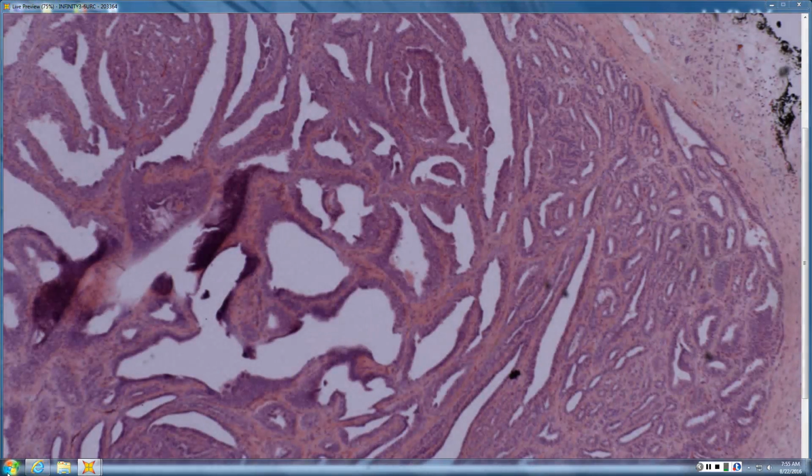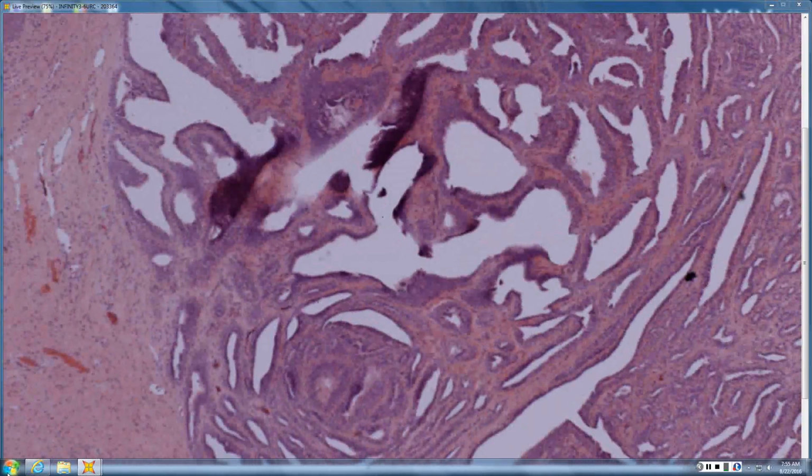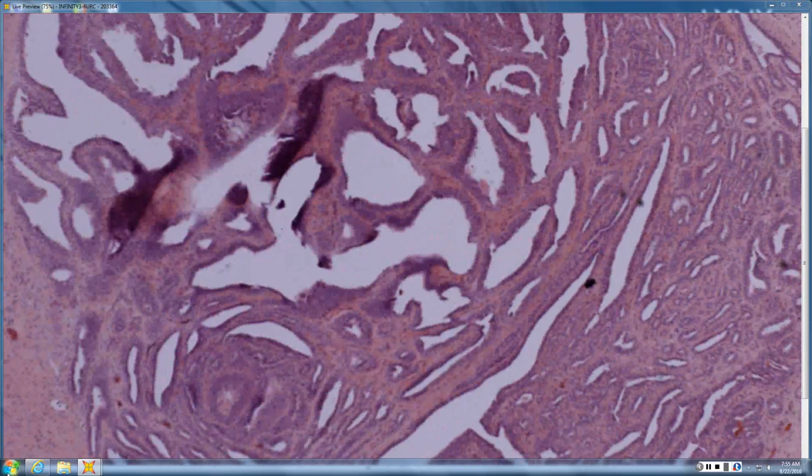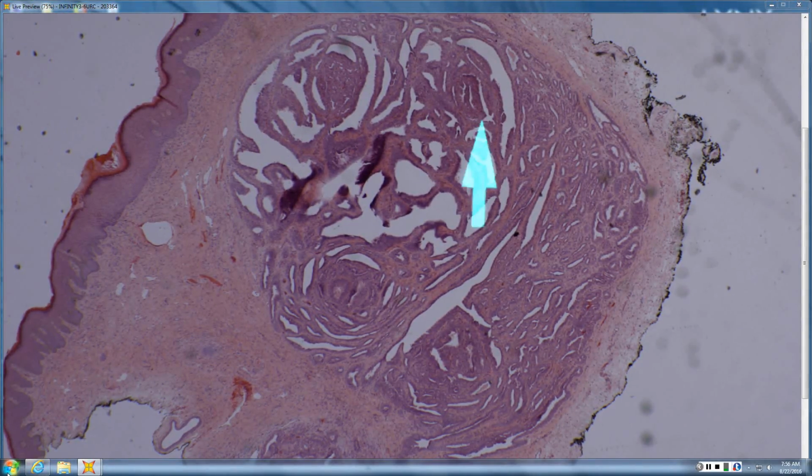Okay, Katie, what do you see here? So, a kind of branching alveolar-like gland. It's pretty well circumscribed, sort of a pseudocapsule. As far as location, it doesn't look acral. I think it could just be an HPAP if it was from the right location. Yeah, so if this were a vulvar tumor, because it is configured like a maze you could hide in, it's an HPAP, whereas the SPAP always connects to the surface so you can slide into the SPAP. So you hide in the HPAP, you slide into the SPAP, right? And both are apocrine tumors.